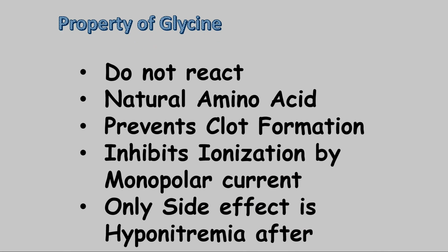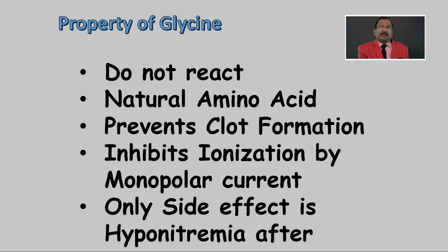So, what is the advantage? If you are doing operative hysteroscopy and you have bleeding, and if the blood coagulates, you are in trouble, because your channel will get blocked. Which channel? The outer sheath. The outer sheath has very small openings.